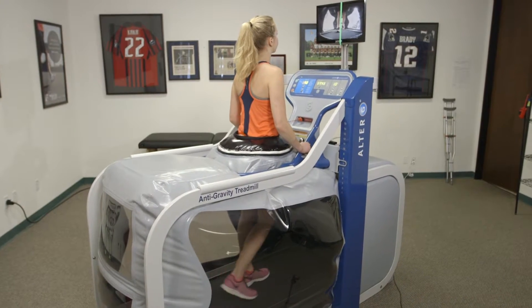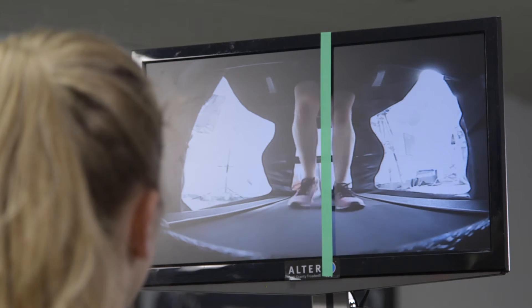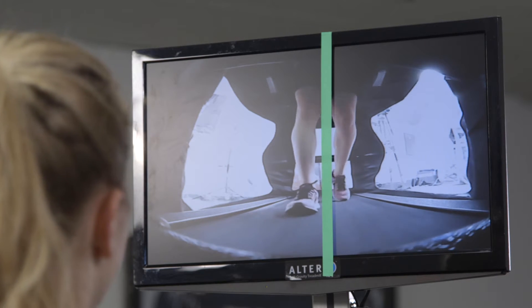Here are some ways you can maximize its use. Use color tape placed on the center of the screen to give patients a visual cue of midline. They can now work on foot placement and landing in a more lateral plane for an increased base of support.